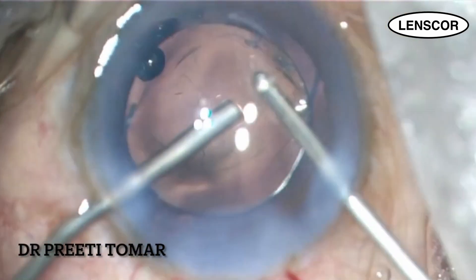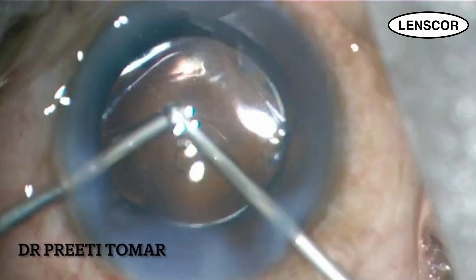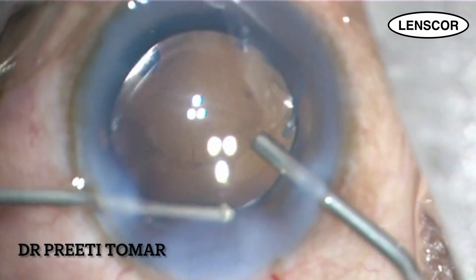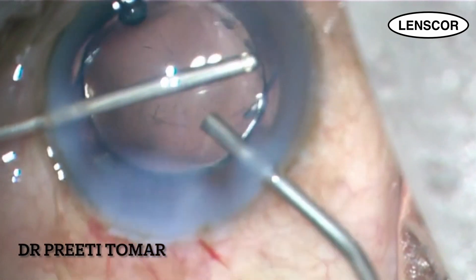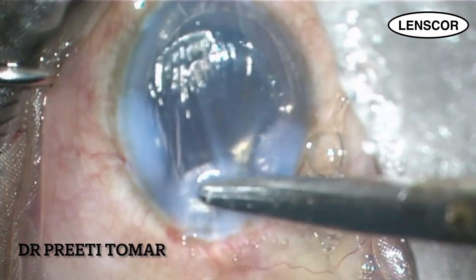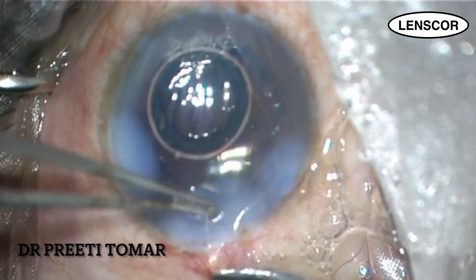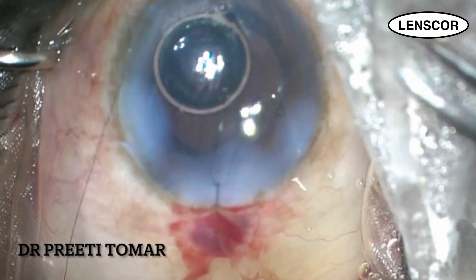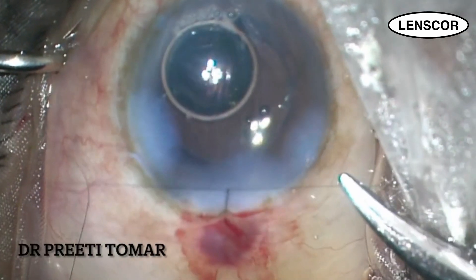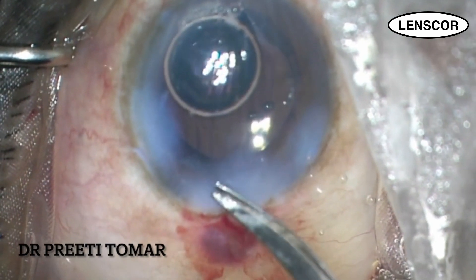After that, I again perform vitrectomy in I/A mode to remove the viscoelastic and do a vitrectomy in a circular fashion all over the pupillary margin in order to cut any vitreous strand coming up to the wound. It's very important to suture the main wound in cases of posterior capsular tear. After injecting an air bubble into the AC, I take a bite through 75% depth of the corneal stroma on one side and two-thirds depth on the scleral side, and lock the suture and tie the knot in 2-1-1 fashion. After suturing, don't forget to bury the knot.